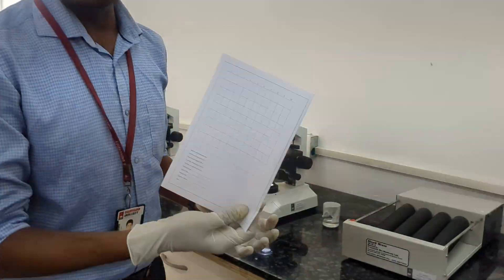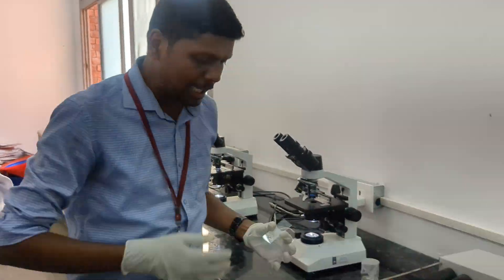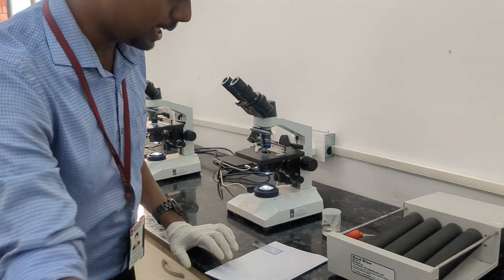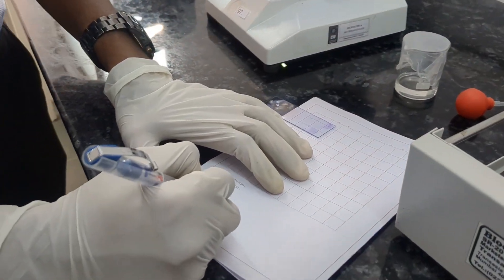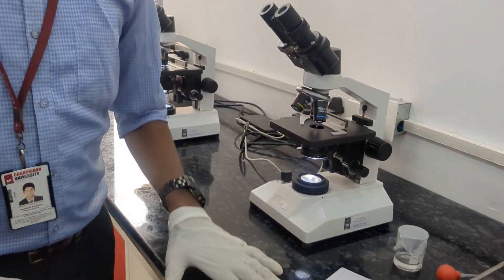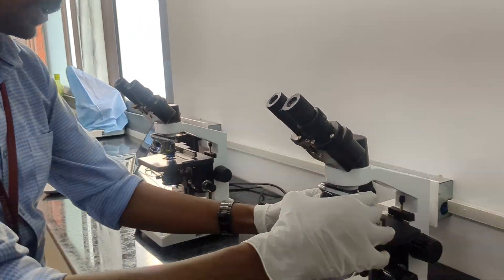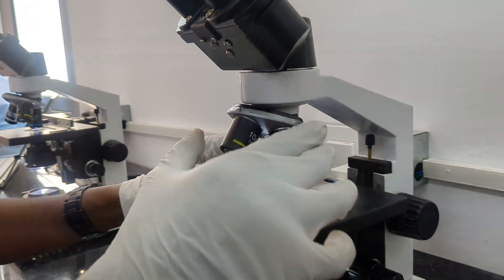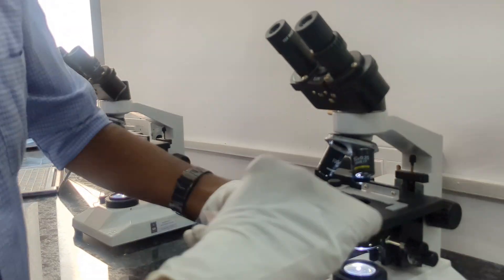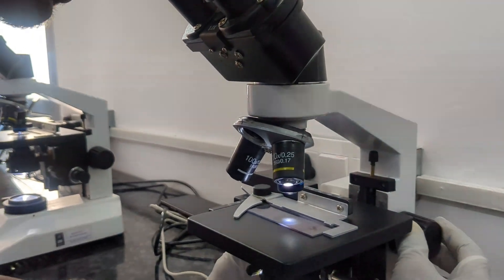I have taken a paper with a 100-cell, 10 by 10 grid. We need to write the patient details — patient name, age, and sex — along with the hospital administration number. After labelling your report, keep the 45X objective in the microscope. Arrange your 45X, keep your smear properly, and we will go for examination of the white blood cells.